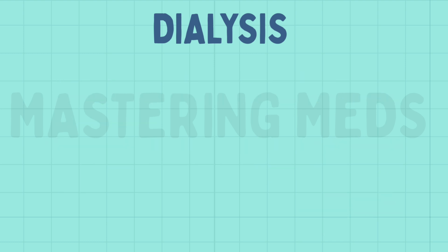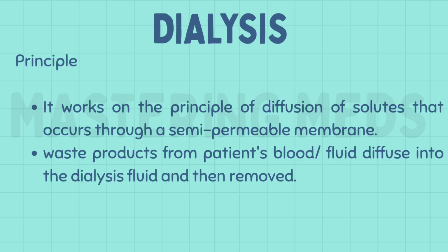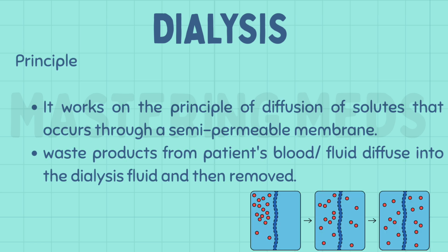At this point, you should be curious how dialysis occurs. What's the principle behind it? It works on the principle of diffusion of solutes that occurs through a semi-permeable membrane. Waste products from the patient's blood diffuse into the dialysis fluid and are then removed.